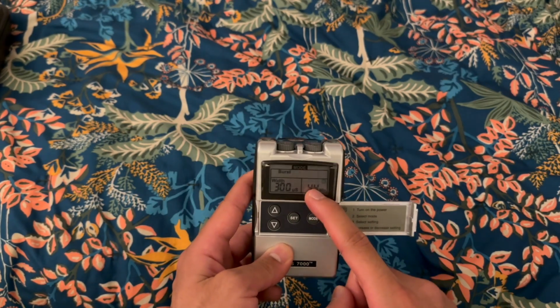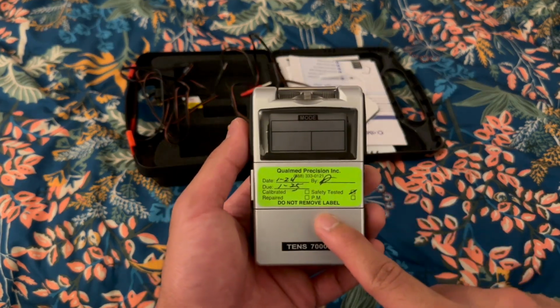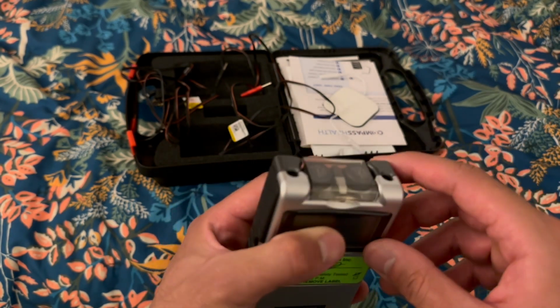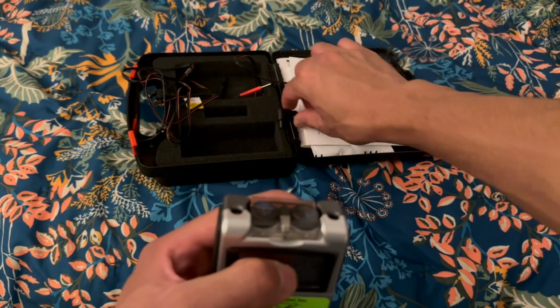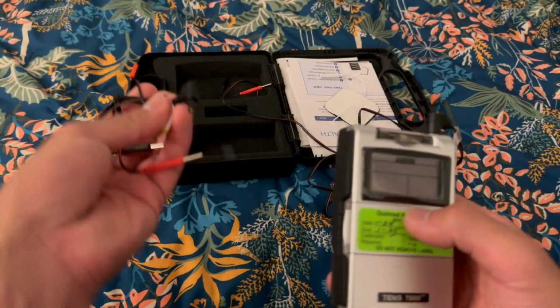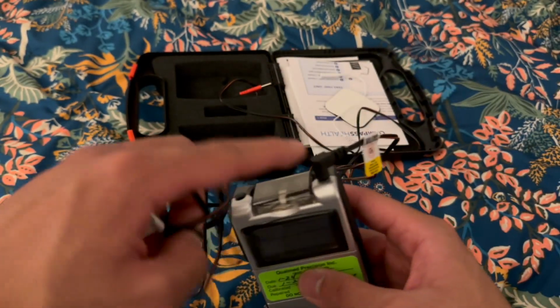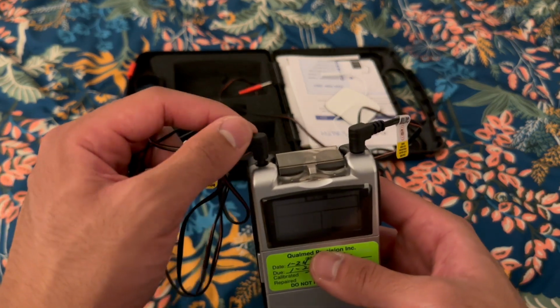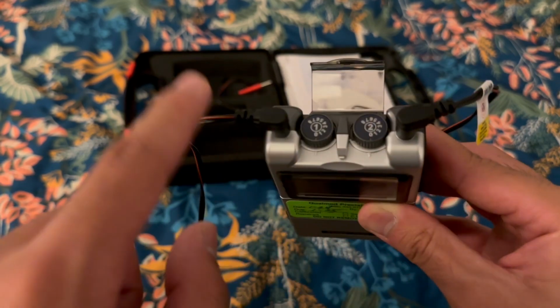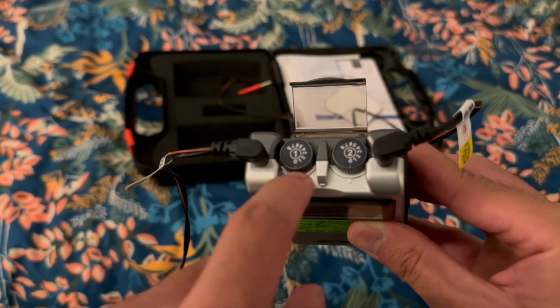So I'll show you guys how I get this set up on a patient, and today the patient's going to be myself. So when we're using the device on ourselves or a patient, we'll make sure that the device is off before we use it. Then we'll plug in our electrode wires. We can either use 1 or 2 channels. Today, for the sake of demonstration purposes, we'll just use 1, but if necessary, we can use 2. And then with the 2 wires attached, we can adjust the intensity for both channels at different feelings.